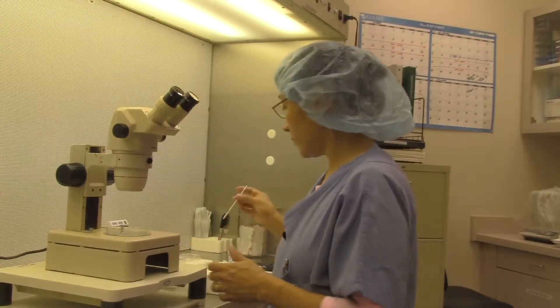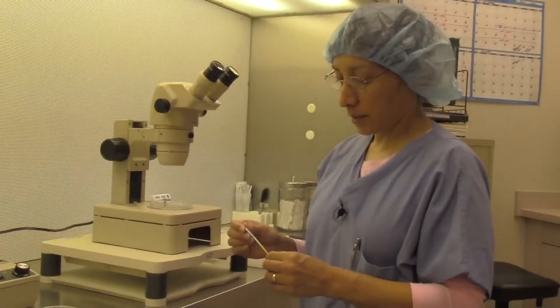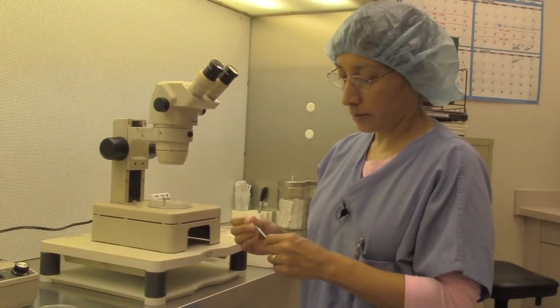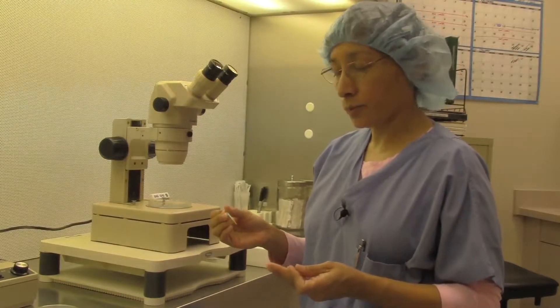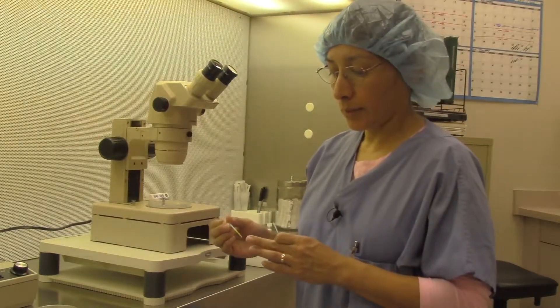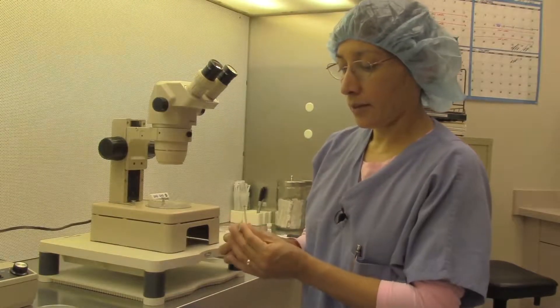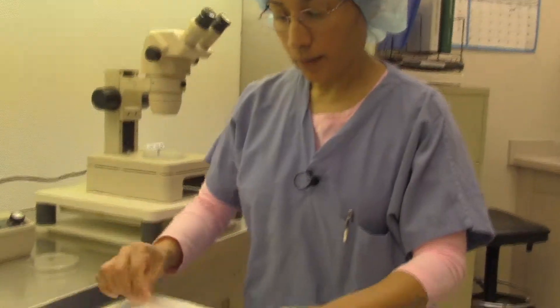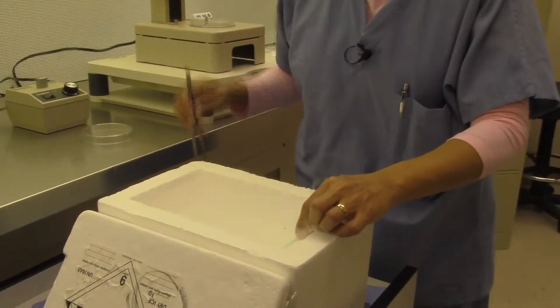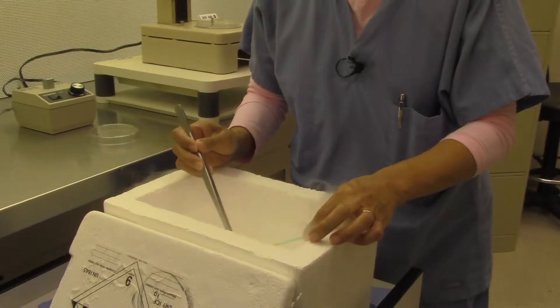We use a vessel here called the vitristraw. It has an outer vessel and an inner vessel. The inner vessel is almost spoon-shaped, where we put the eggs on the tip with a little bit of media, and then they are dunked into liquid nitrogen. The outer vessel is then placed onto the inner vessel where the egg is frozen.